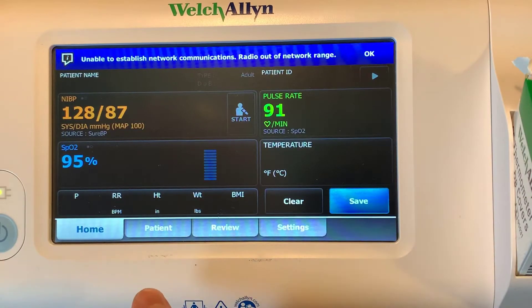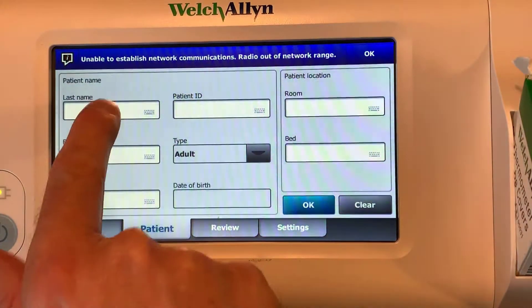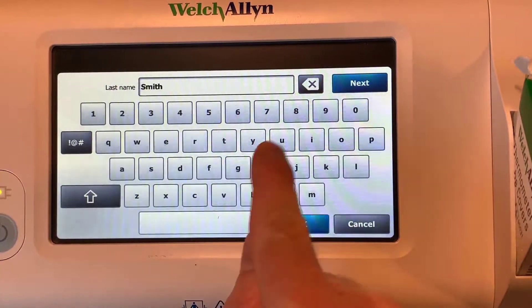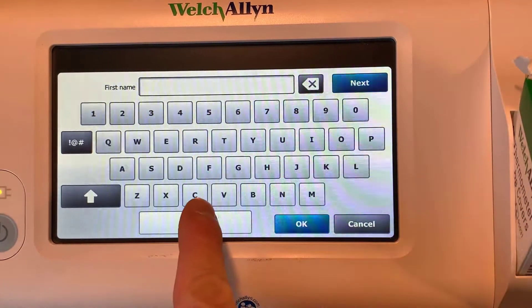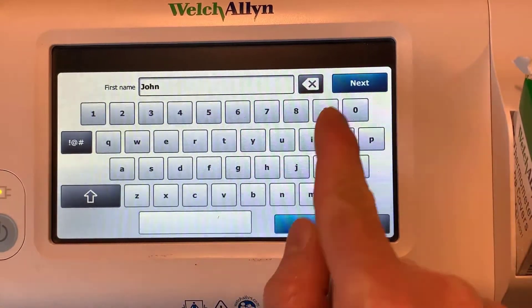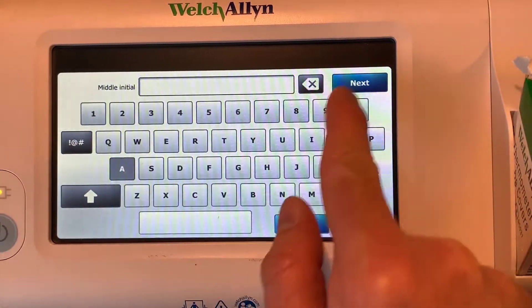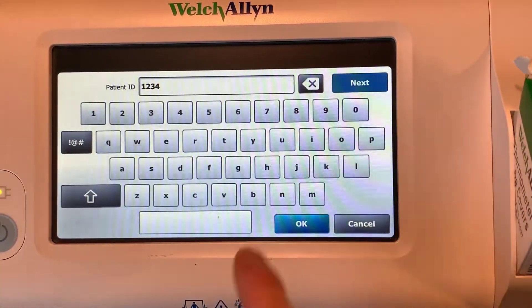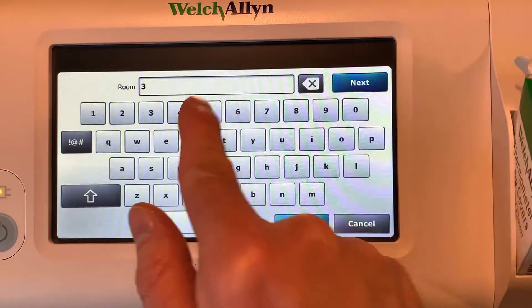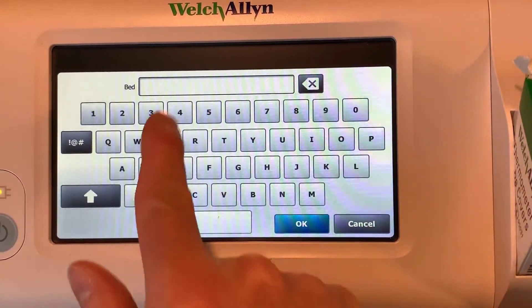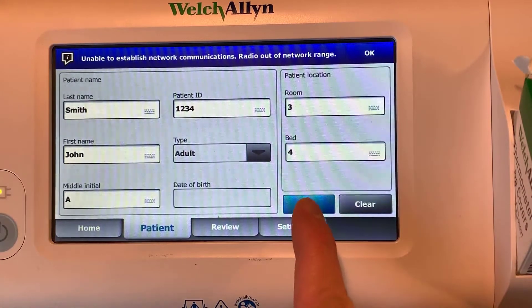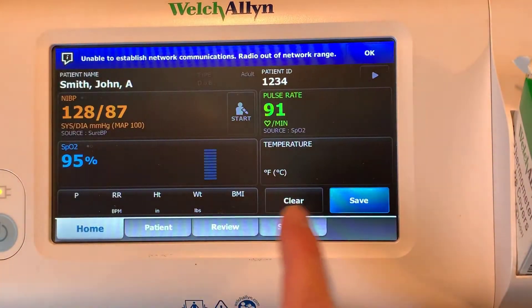I just went ahead and took my blood pressure and at this point I'm going to enter in some of the patient information. I'm going to enter in the first name — it's last name first and then first. The rest of these fields for the most part are not going to be carried over, but we can enter in patient ID, and then just enter in something for room number and bed number.